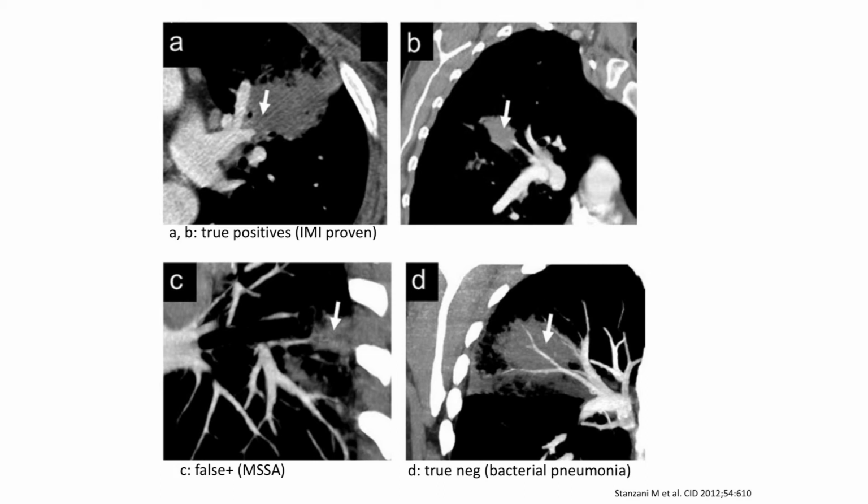You can do this if you are desperate. Nowadays, we are less desperate because of things like galactomannan. But these are just good things to know. The other thing is that we often do a CT scan in our patients without CT contrast because you know that these patients are already suffering from aminoglycosides and cyclosporin and tacrolimus.